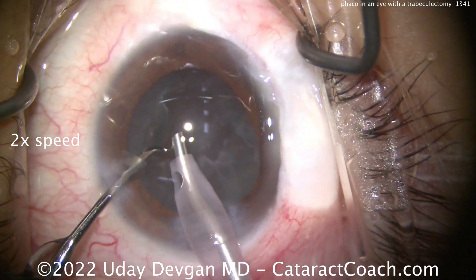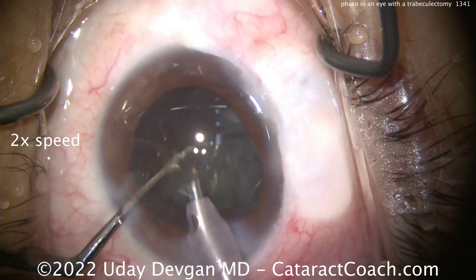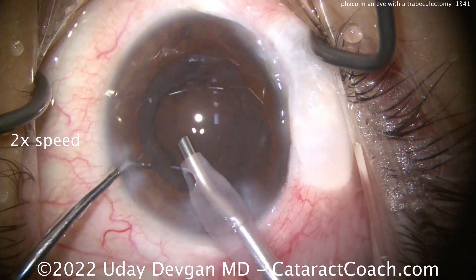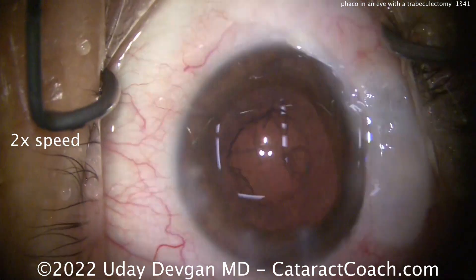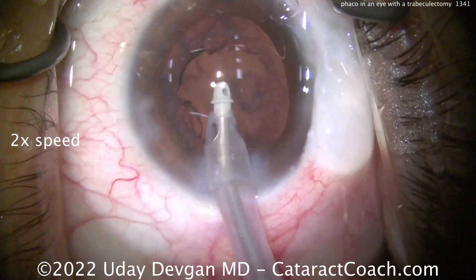In a case like this, you may want to slow down your aspiration flow rate so things happen a little slower. Also drop that infusion pressure. There's the epinuclear shell looking pretty good. And there's that 4.5 mm rhexis we talked about — also look at the incision: longer tunnel length, and that incision is going to seal very well.